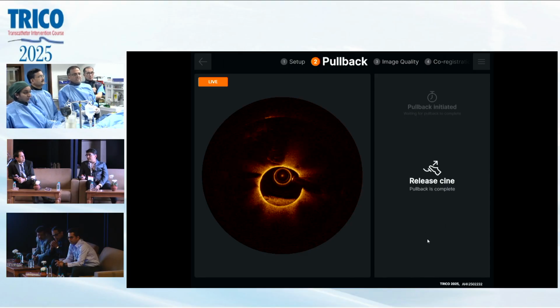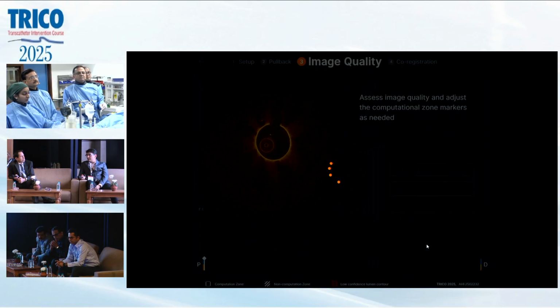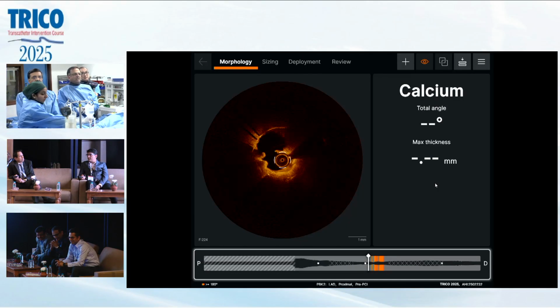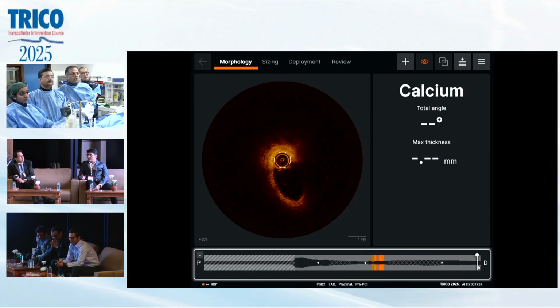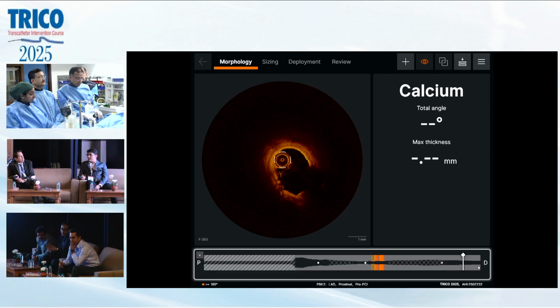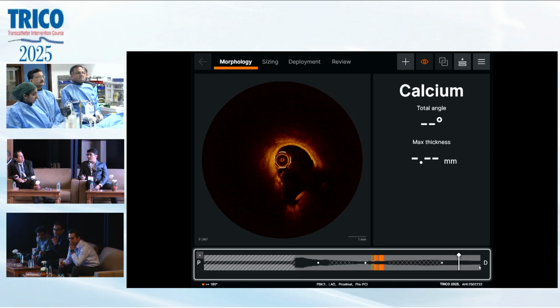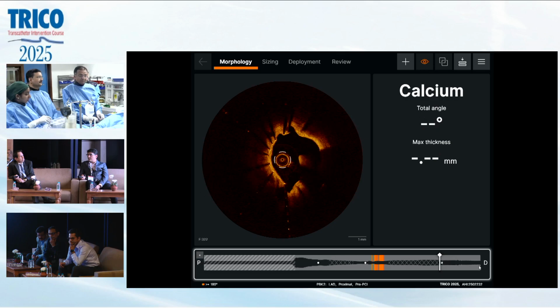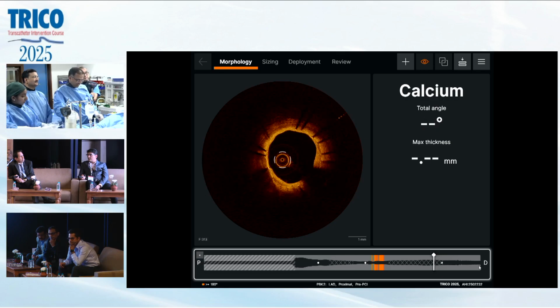Pressure is decent so far. You can see it's still occlusive, even though you dilated it. Yes, but the flow is still not normal. I think automatic is more difficult. Let me apply manual; I think manual check is better. He doesn't like anything sitting in there. Pressure is already sinking a little.